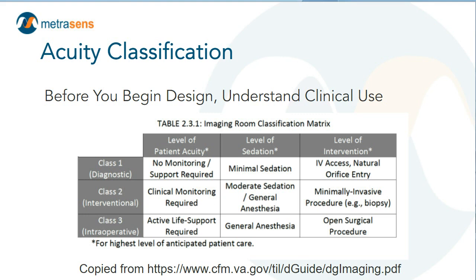And we too often copied and pasted that prototype, not recognizing that the clinical and operational needs of that MRI scanner are going to vary depending on the clinical expectations or demands of the location. Putting an MRI that is used by ED patients or ICU patients or post-surgical patients is going to require different infrastructural preparations than one that goes into a physician's office.